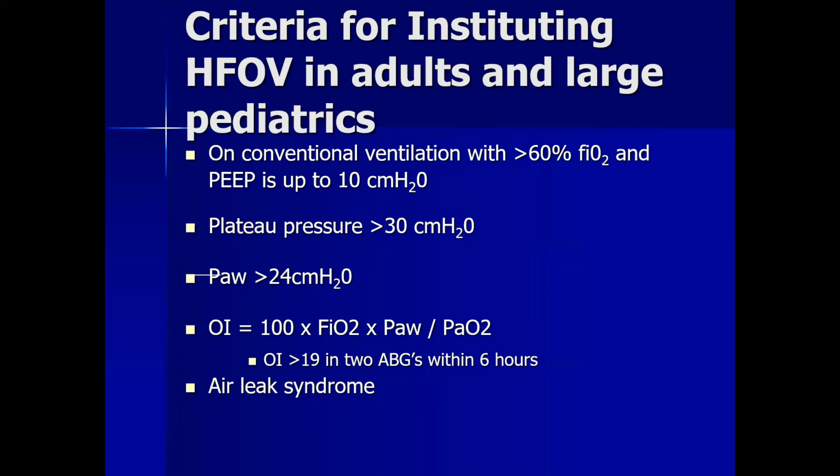Was it because they went on the oscillator, or was it because they were already dying and the oscillator was used too late? They found some faults in that study, and still I don't see it coming back. So as you go through pediatric ICU, maybe you'll still see it. Most likely you'll only see it in NICU.